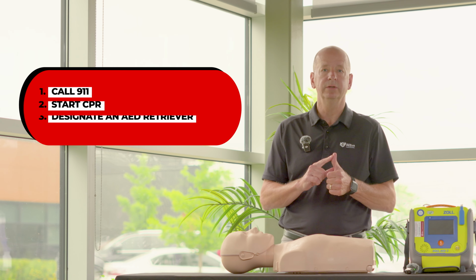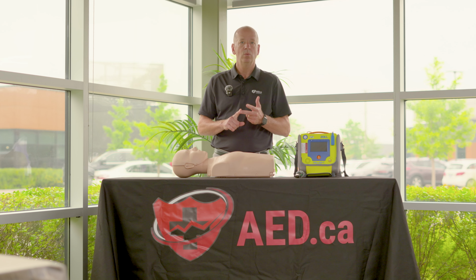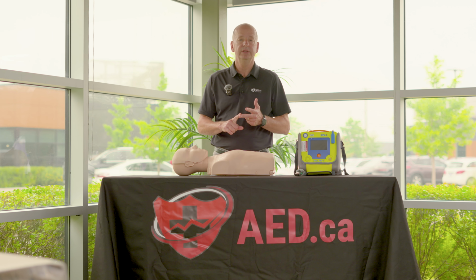3 steps to follow. 1. Call 911. 2. Start CPR. And 3. Have someone retrieve the AED. Once it arrives, turn it on and follow the instructions.